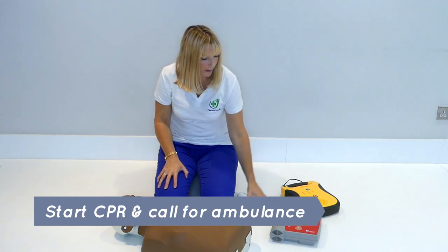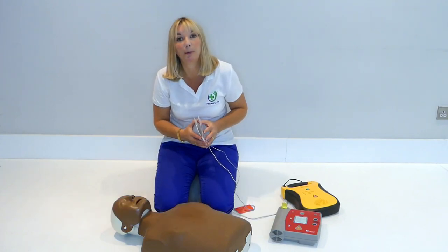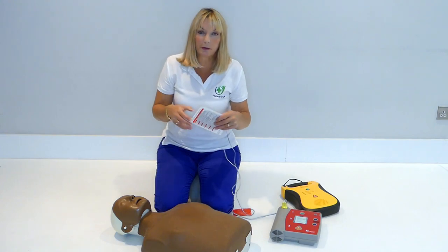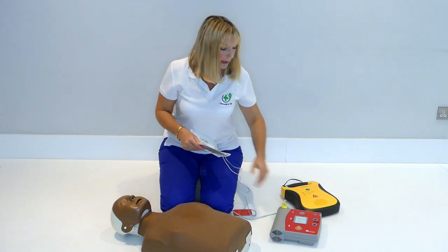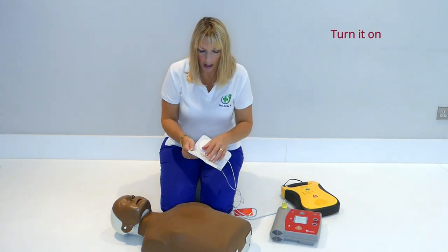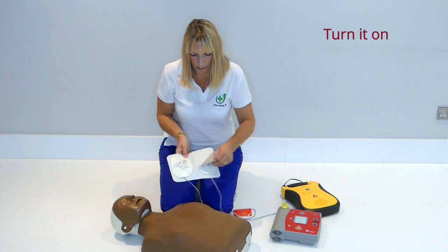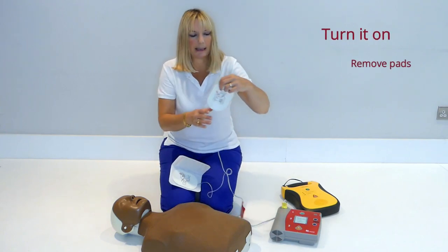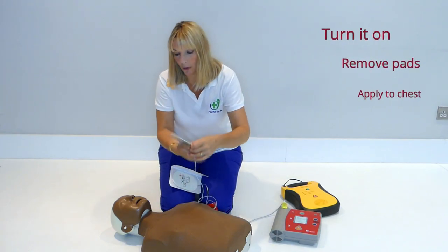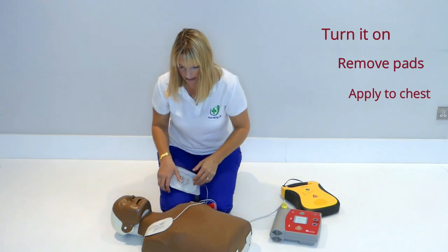Get an ambulance on the way as quickly as possible and ideally grab your defibrillator. To use your defibrillator, you would turn it on and then remove the pads and put them as shown on the pads.